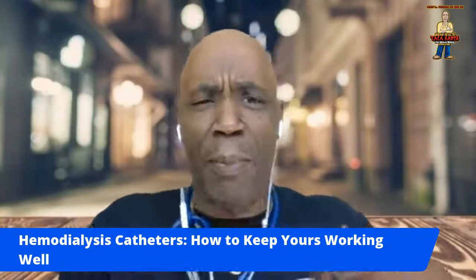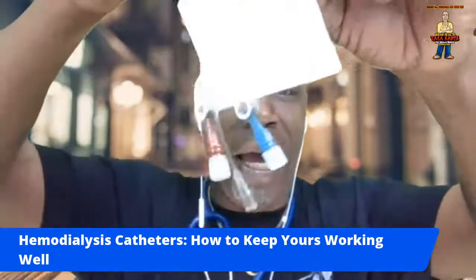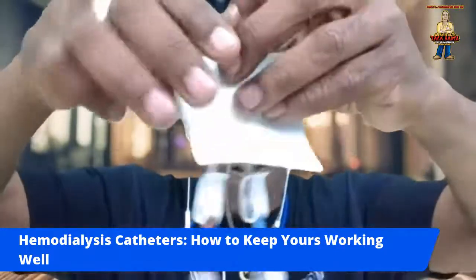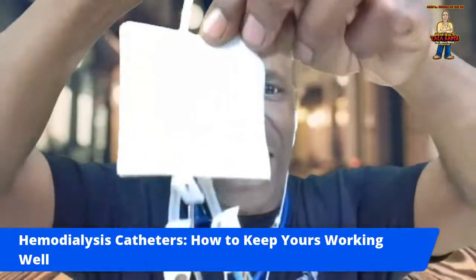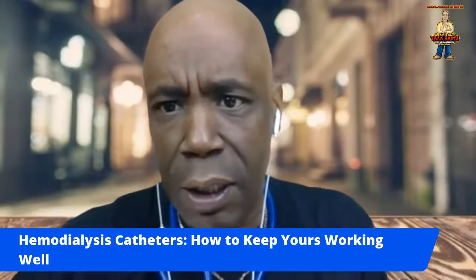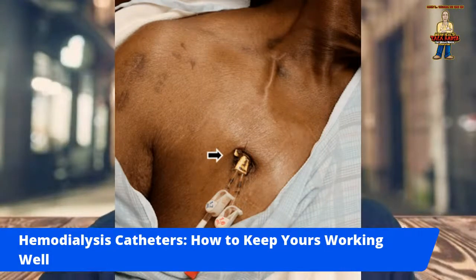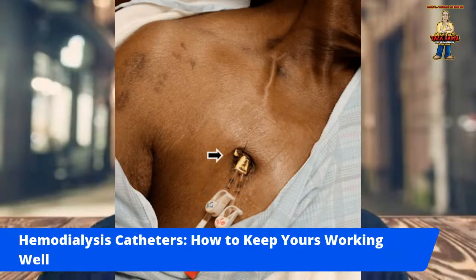But some warriors do take showers. They put saran wrap over the dressing. You may have a catheter that has a dressing like this on it, and the dressing kind of looks like that. If this gets wet, then the skin is exposed like this. The skin is exposed if it's missing the dressing. But some warriors wrap saran wrap around their dressing, and don't let the water from the shower hit the catheter area.